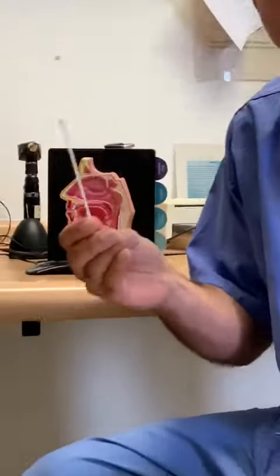This is a standard dry swab. There's a little mark at about 7cm back to guide you about how far to push in the nose.